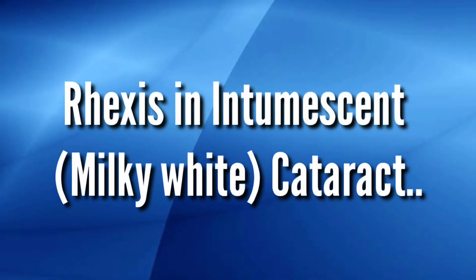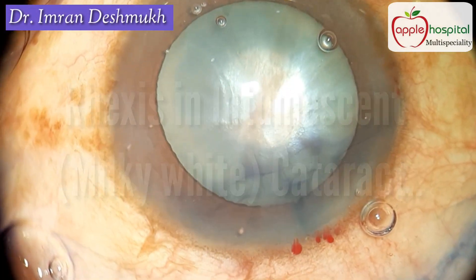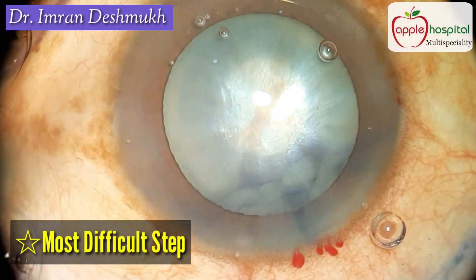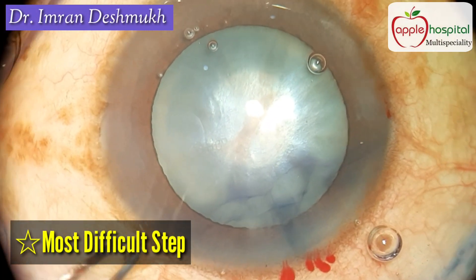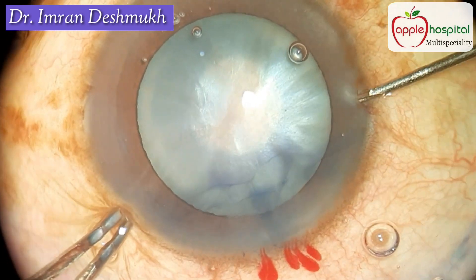Hello everyone. Today we'll be discussing how to make a rhexis in a white milky intumescent cataract, and believe me, this is the most difficult and toughest step during phacoemulsification of a white milky cataract.